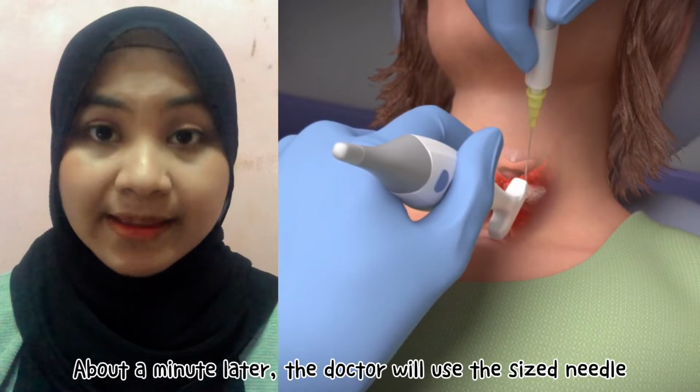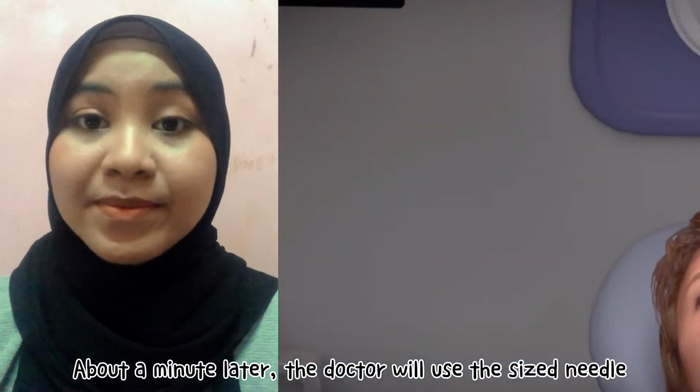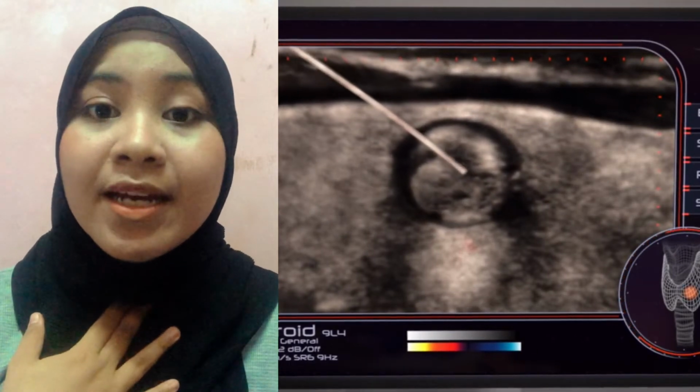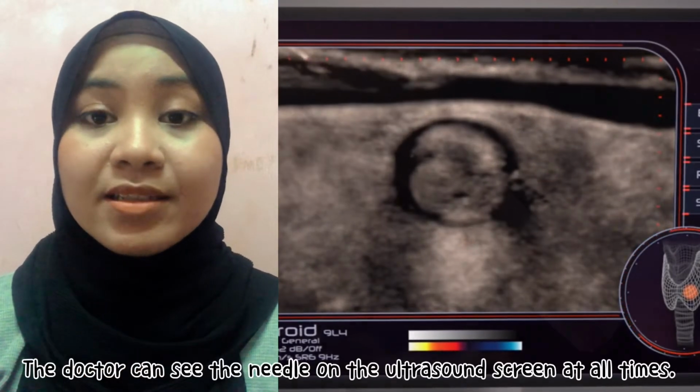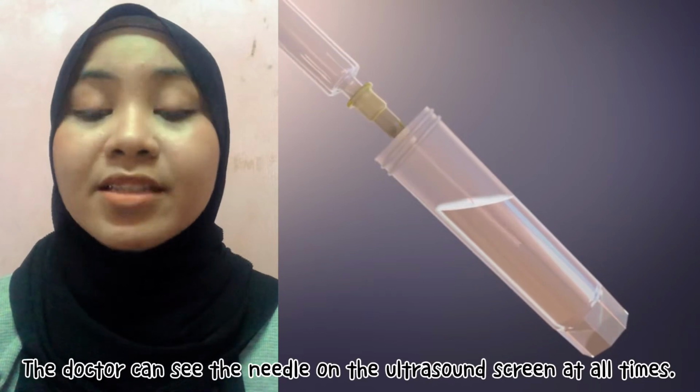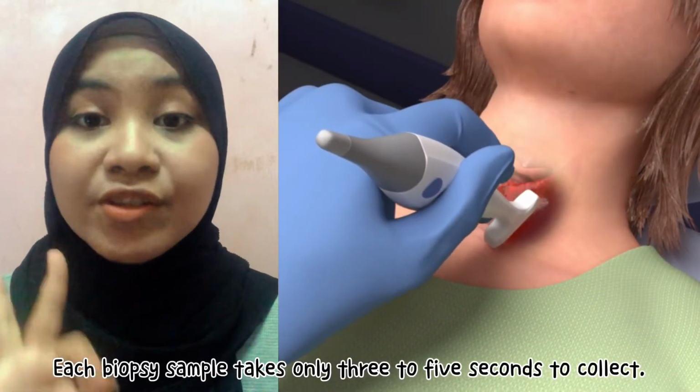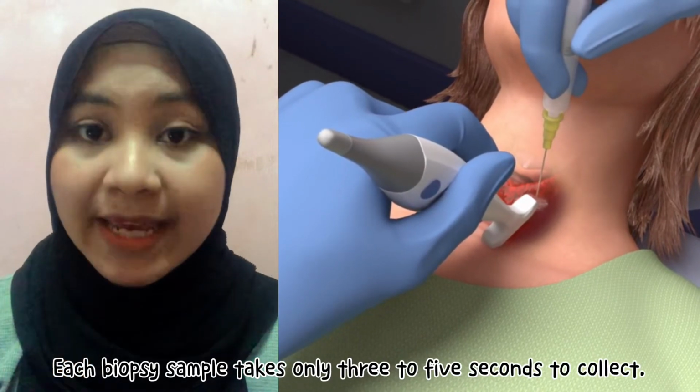About 1 minute later, the doctor will use the same size needle to collect a tissue sample from your nodules. The doctor can see the needle on the ultrasound screen at all times. Each biopsy sample takes only 3 to 5 seconds to collect.